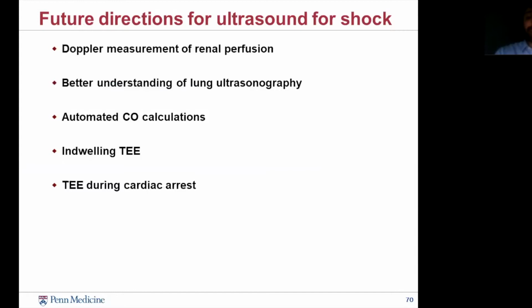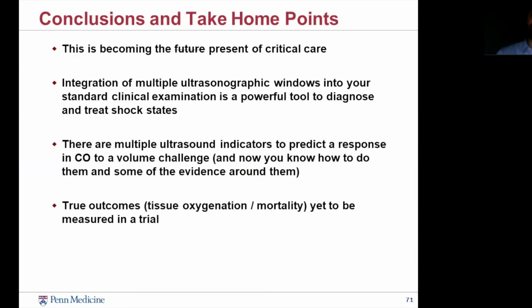And then in our emergency department, we started using transesophageal echocardiogram during cardiac arrest in order to determine everything from, are the compressor's hands in the right place during CPR, or whether there's an answer for why the patient had a cardiac arrest to begin with. And there's some very interesting results coming out from that, especially in the last 2 years. The REASON trial is the name of one of the studies.